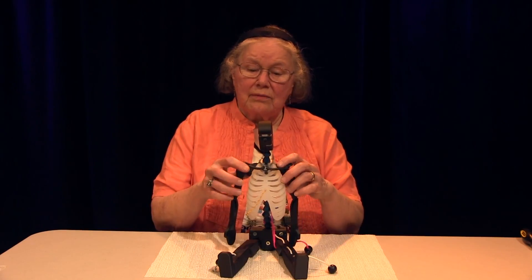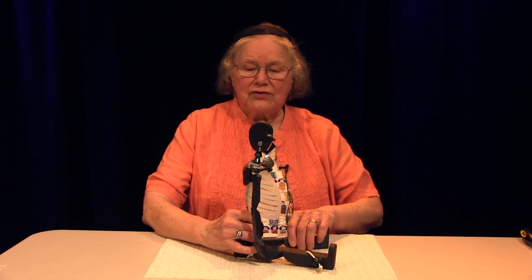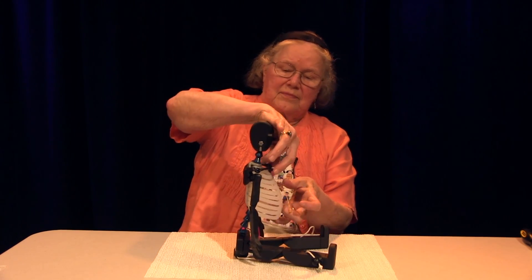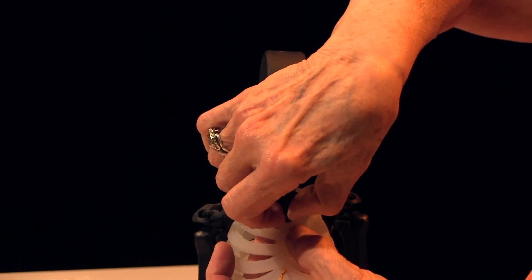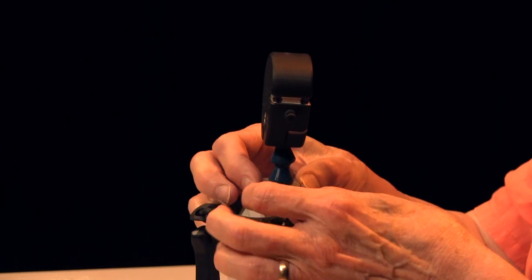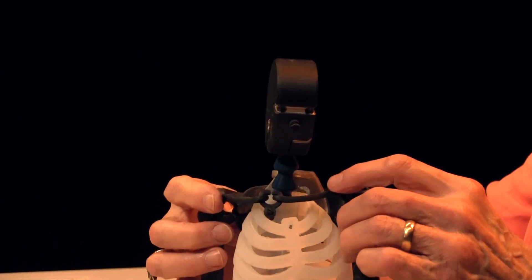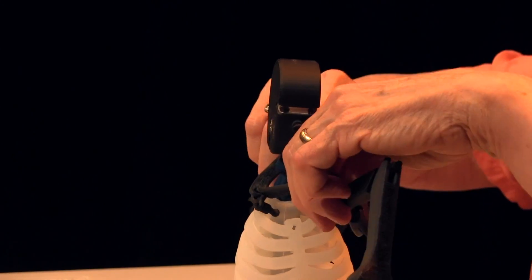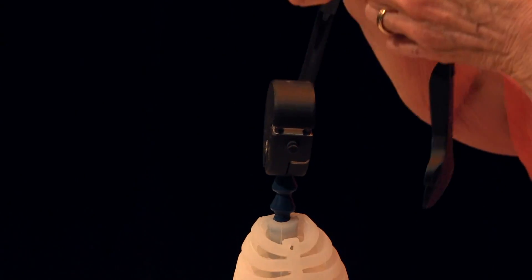To remove HAMI's arms, reverse the process. Turn HAMI sideways. Unbutton the sternal button. Unclip the vertebral scapular clip. Upwardly rotate the scapula. Rotate and slide it over HAMI's head.